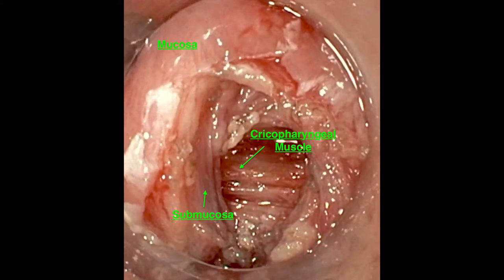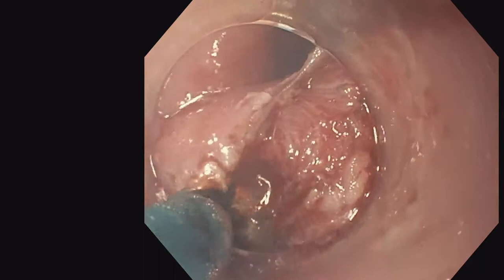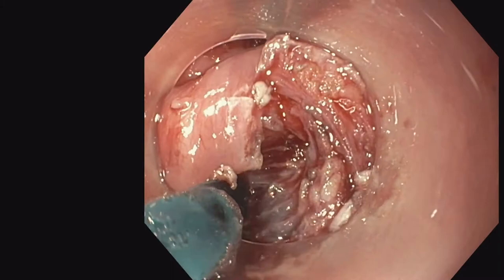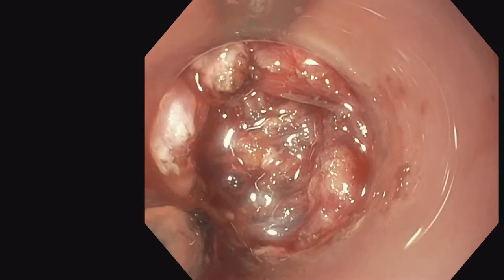Understanding the layers will keep you away from complications, but also allow you to perform a complete dissection. One of the pitfalls in the flexible endoscopic approach is the lack of complete dissection of all cricopharyngeal muscle fibers, which can lead to elevated levels of recurrence if not properly performed. Here you're seeing dissection of that cricopharyngeal muscle. It's important to dissect all of the muscle fibers to reduce the chance of recurrence and get the best potential outcome for your patient.